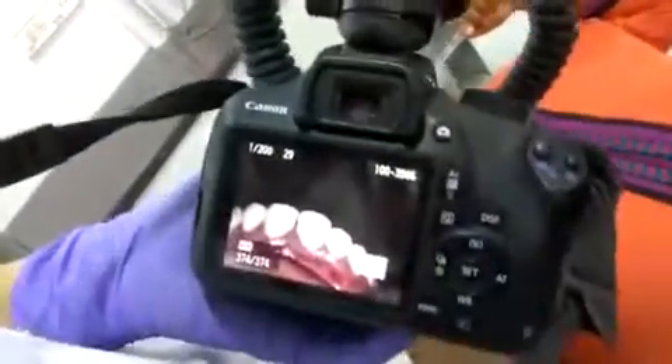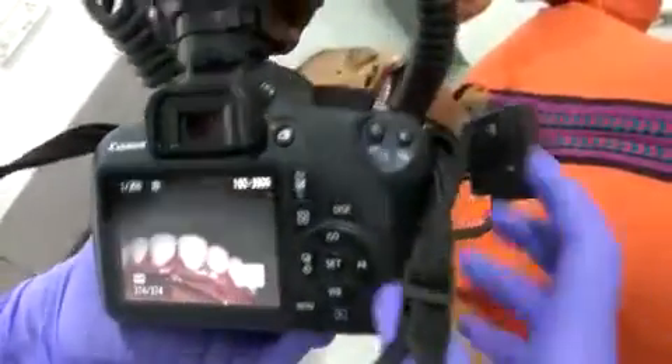We get a nice clear picture of all the teeth right there. And we can even try taking one from the front — I think that should help us.